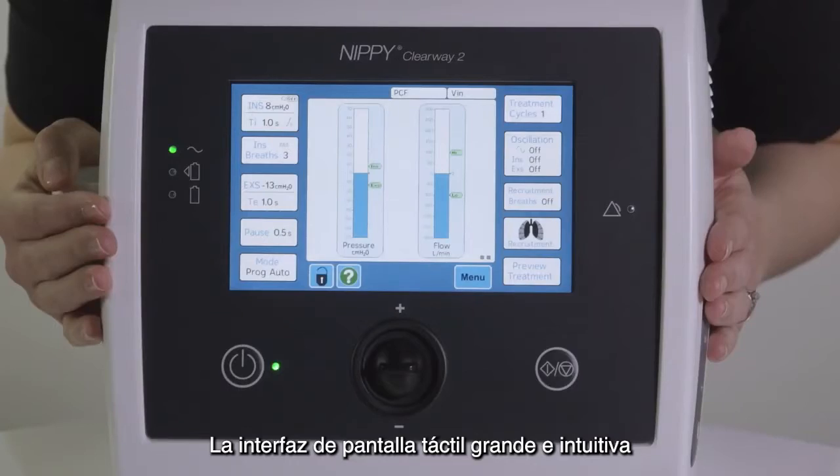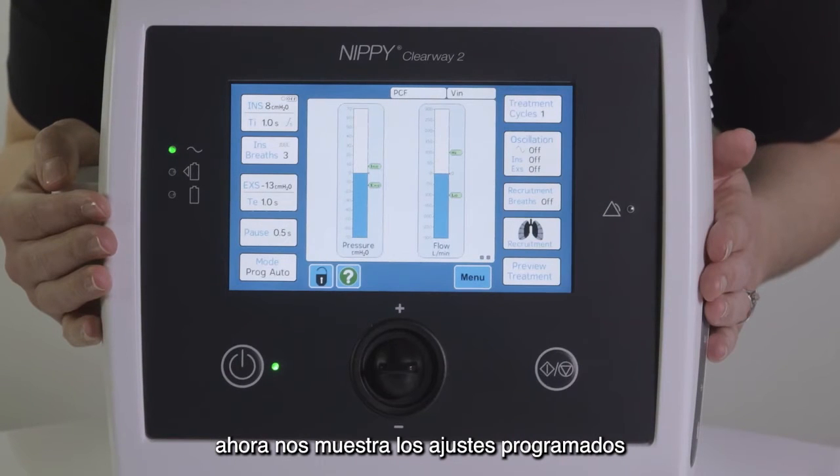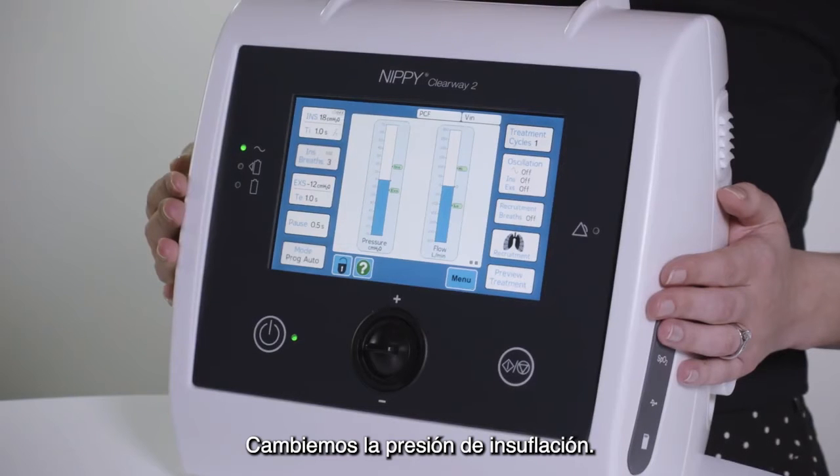The large intuitive touch screen interface now shows the settings that are currently programmed in the Clearway 2. Let's change the insufflation pressure setting.